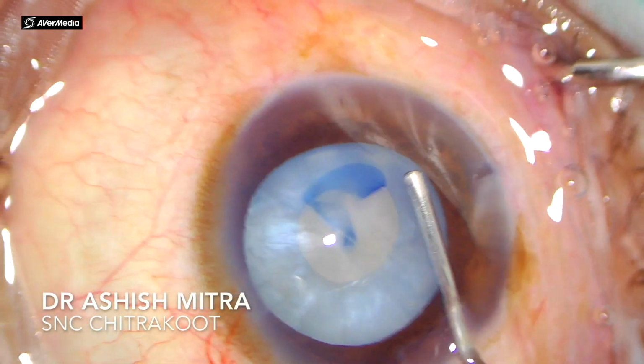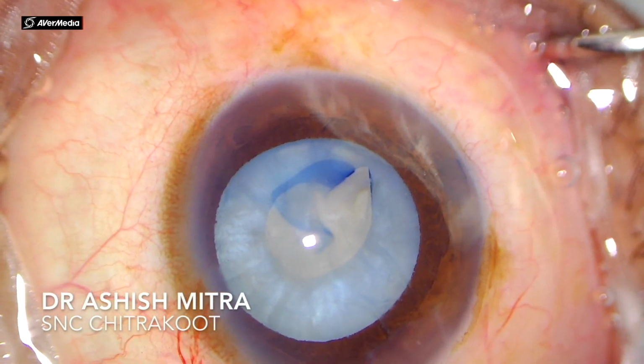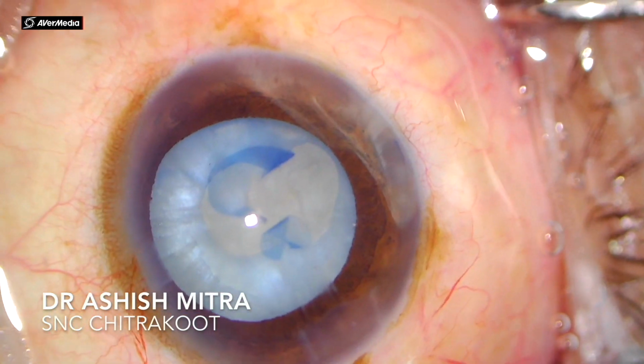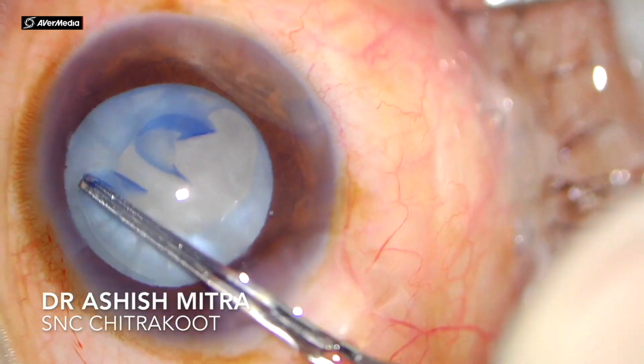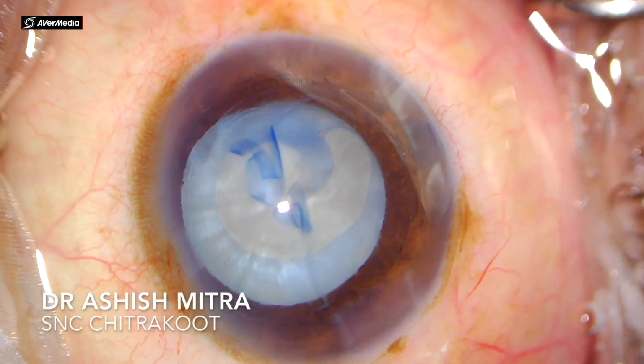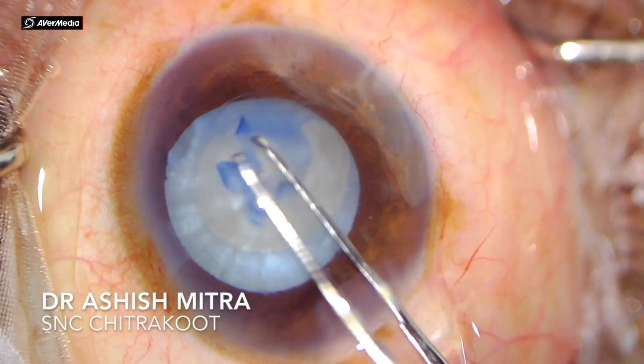The second case was an intumescent case, and I was just debulking, and then I created a flap. I thought this could extend and cause a PCR, but then I took a reverse turn and I used this flap to complete the rexis. My only intention was to cover the initial flap which was trying to extend, and I was quite successful.